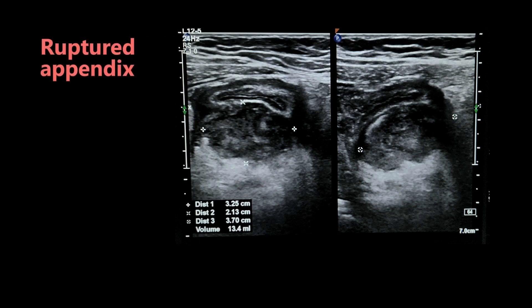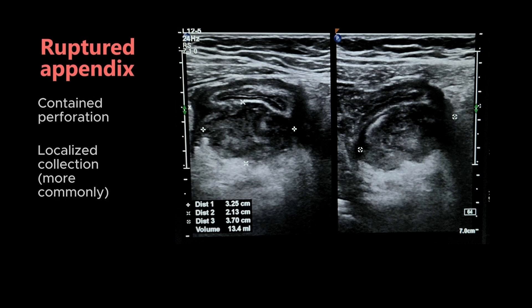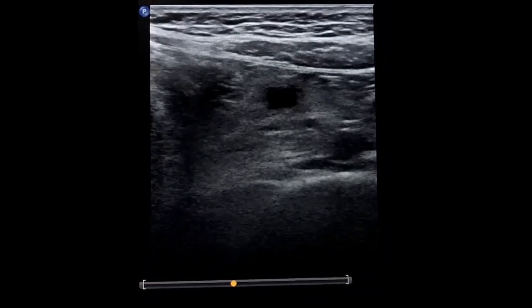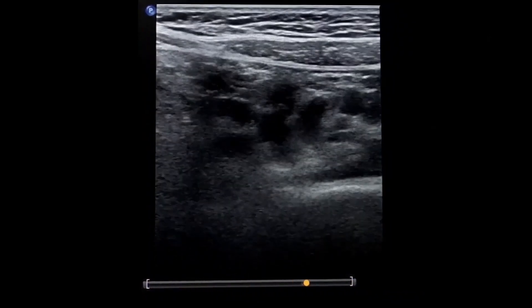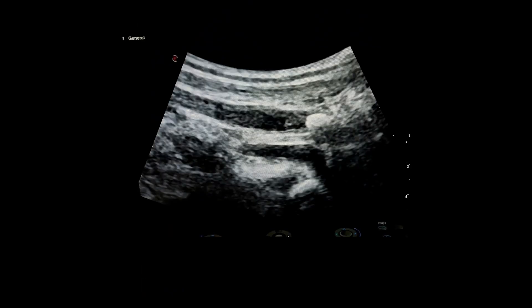This was a case of ruptured appendicitis. A contained perforation or localized collection is more common than free spill in a ruptured appendix. We should also look for associated lymphadenopathy, with above 8 mm short axis diameter as the cutoff.